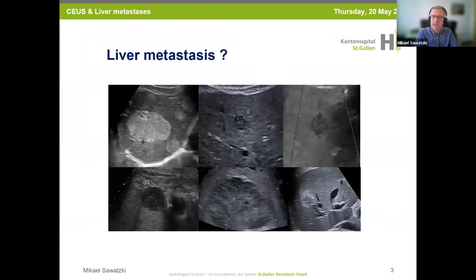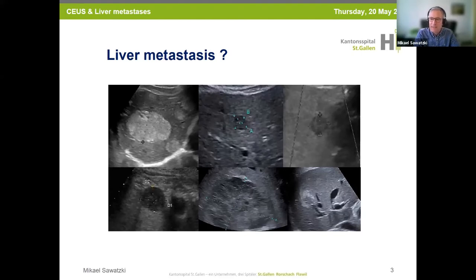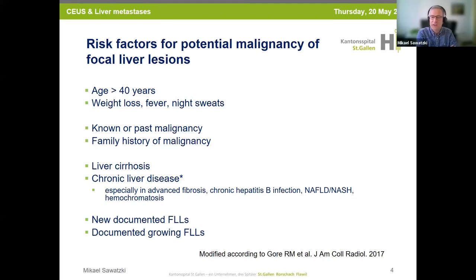I present to you now six grayscale ultrasound images with the question: can you diagnose the liver metastasis? One of your answers could be that this question makes no sense — and that would be a very good answer, because you have no information about the patient. It's not possible to make a very good diagnosis in each case. Risk factors are very important for potential malignancy.